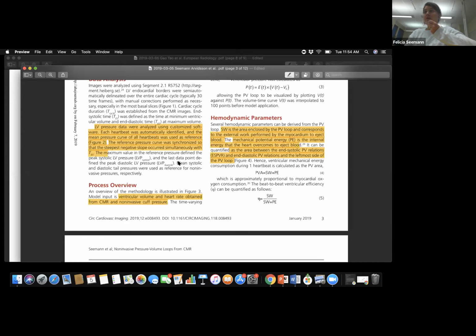And just as you said, it will not work if you have a stenotic aortic valve. This is also a very rough approximation of this pressure. I've read a few papers where they're doing applanation tonometry, where they're getting more accurate backward tracking of this pressure, so I think that could be an interesting way of making the method even more robust.